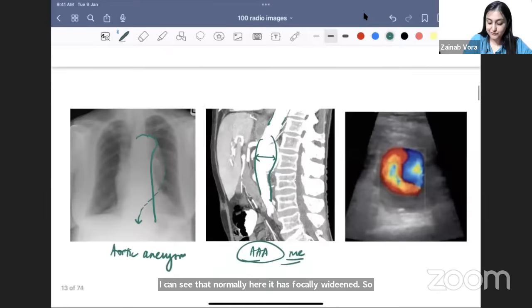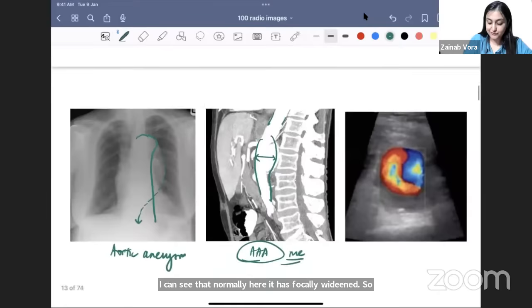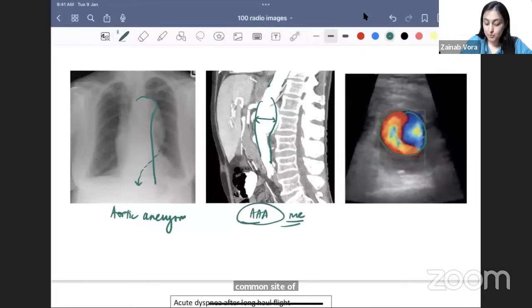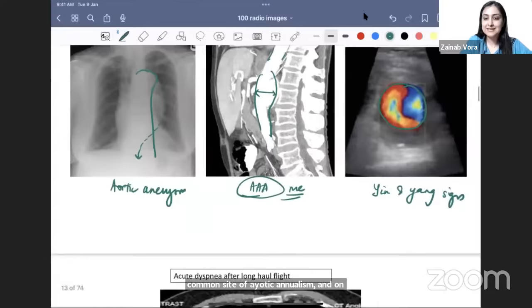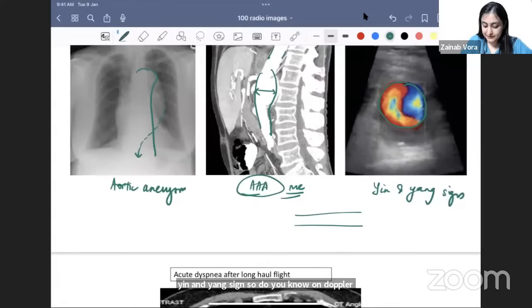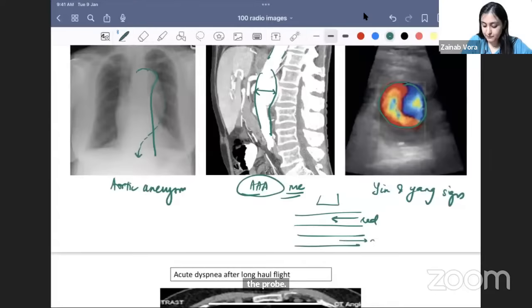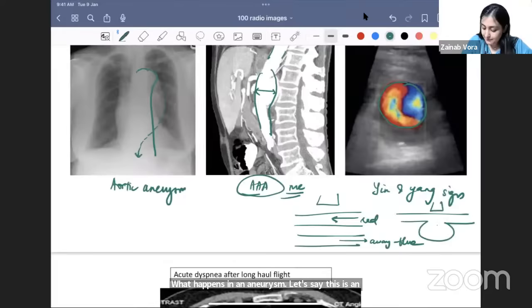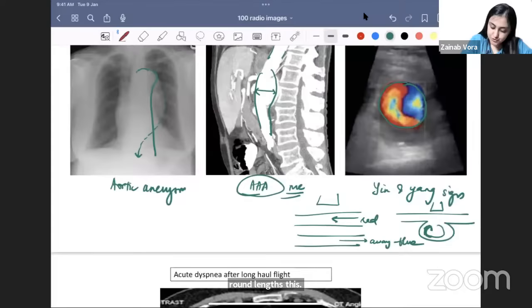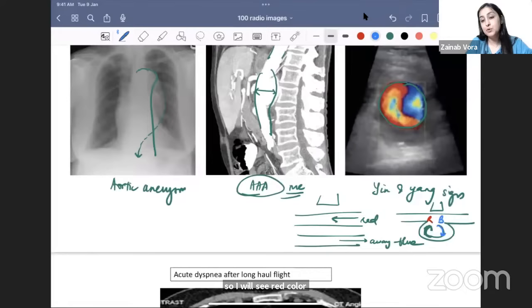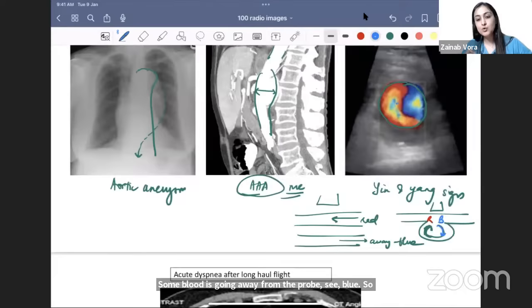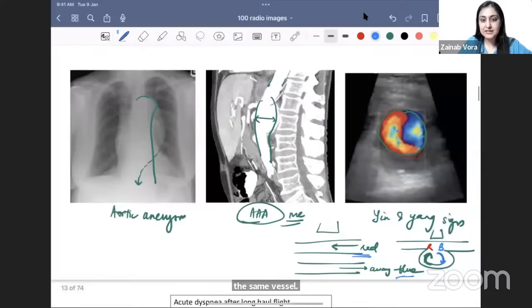On Doppler, we see the yin and yang sign — both red and blue in the same vessel. Normally in a vessel, red means flow towards the probe and blue means flow away. In an aneurysm, blood swirls round and round: some goes toward the probe (red) and some away (blue), giving the yin and yang sign. This is the only place you see both colors in the same vessel.